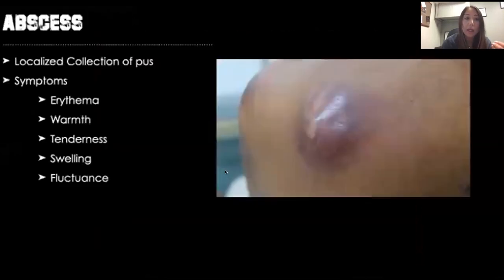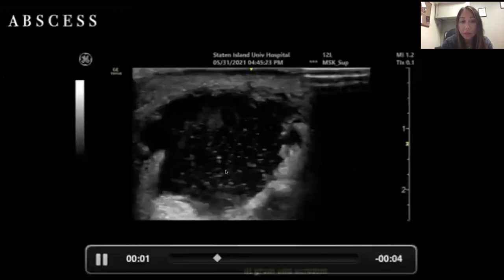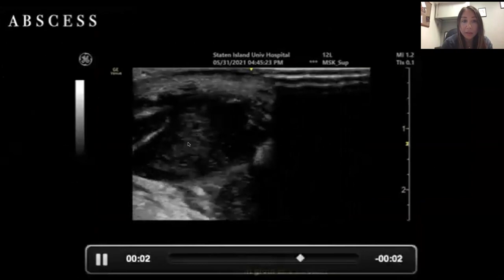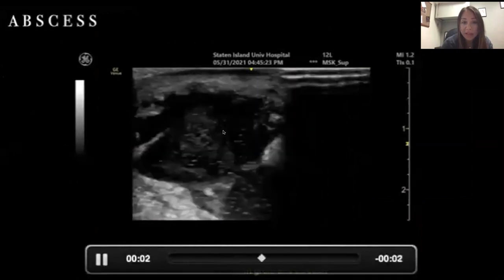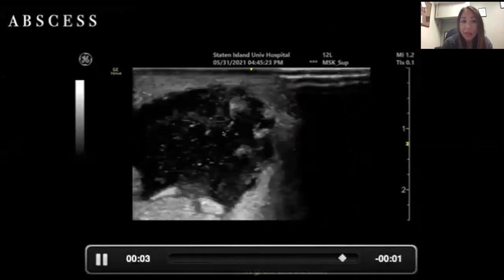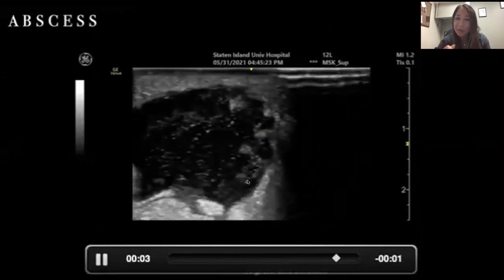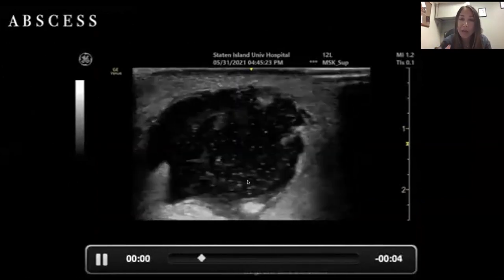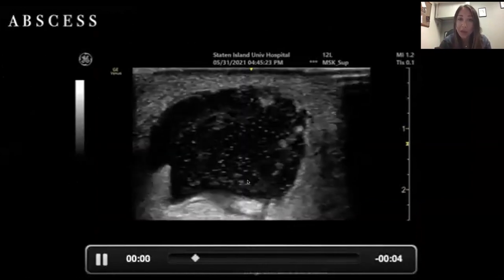Abscesses are a localized collection of pus. You can have erythema, warmth, tenderness, swelling, and fluctuance. This is an example of an abscess — you can see it's hypoechoic with a little bit of debris. Here we're pushing it and it has a squish sign, so abscesses can be fluctuant and you can squish them on ultrasound. You can also measure how deep an abscess is, so if you are draining at bedside you can do a pre and post assessment.